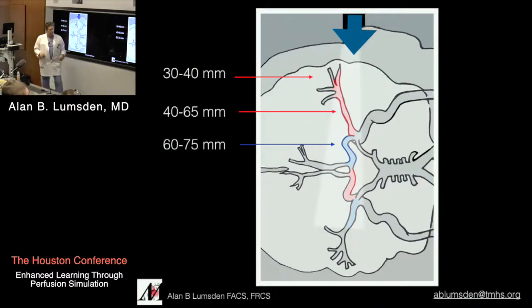Now, the criticism of TCD is it's too sensitive, okay? It tells me stuff that is irrelevant. That's the big criticism. Every surgeon you talk to is going to say this to you. So here's the defense: we accept it probably shows you more than you really want to hear. It's very sensitive. This will detect down to 4 micron pieces that are going up there. Some of that may not be clinically relevant.